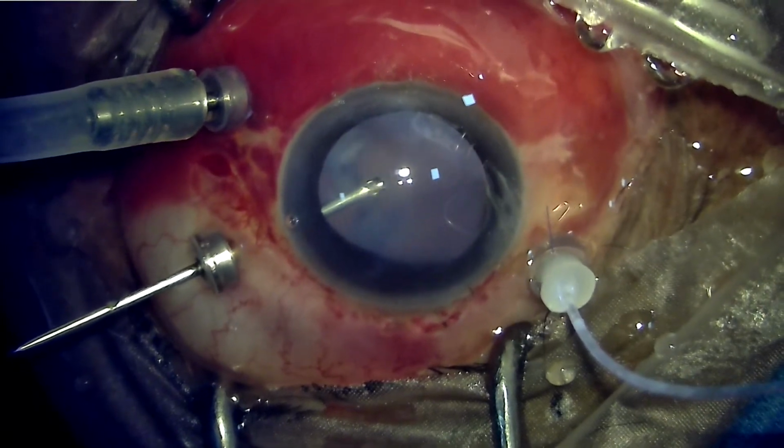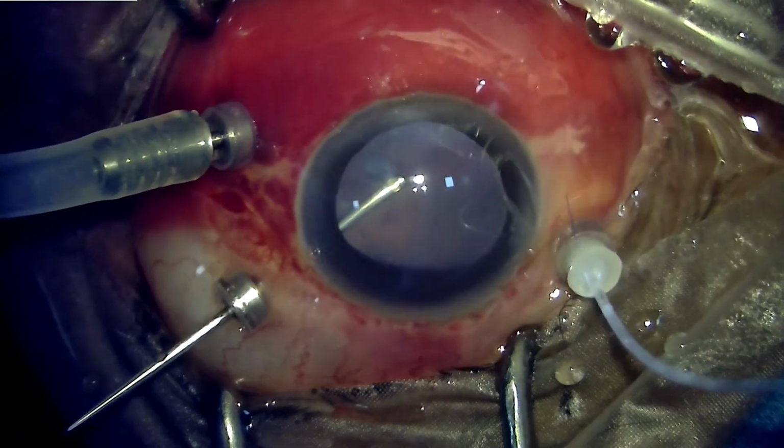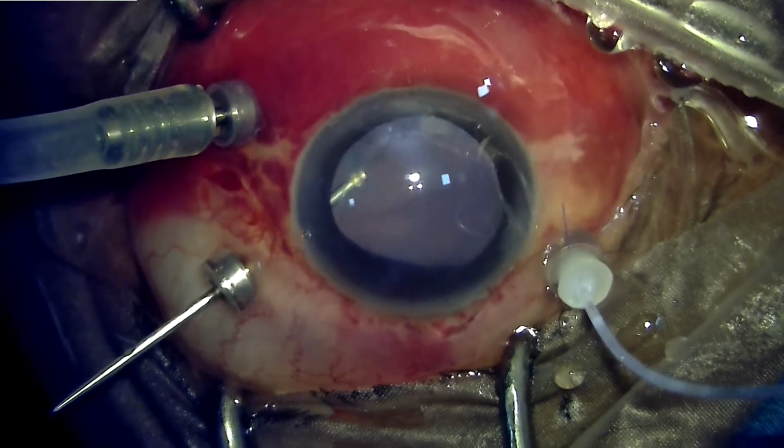Now I'll mention here that this kind of vitrectomy needs pull and cut. So you need to have a dual linear switch by using which you can switch from pulling to cutting on the fly. Now this is staining the vitreous with triamcinolone.